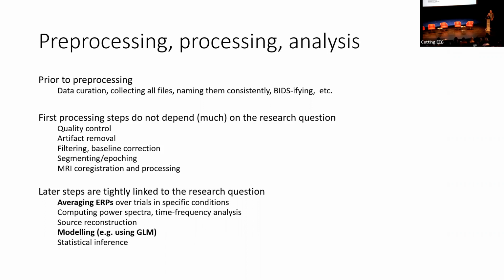What I'm going to focus on is the averaging of event-related potentials. And I'm going to link this a little bit to statistics. So tomorrow we're going to deal with statistics in a much more elaborate fashion. So I'll very shortly touch upon it, but I think it's a relevant thing in relation to event-related potentials that I want to highlight.